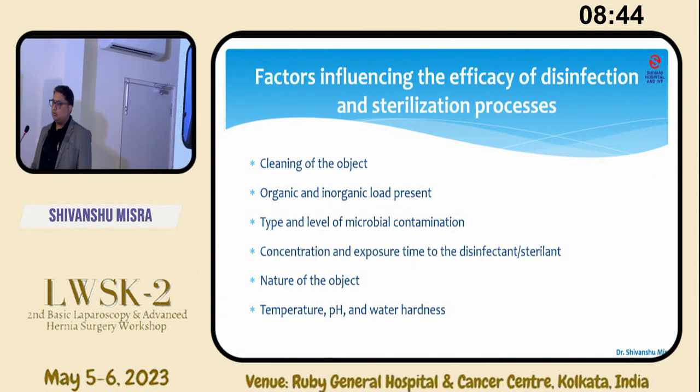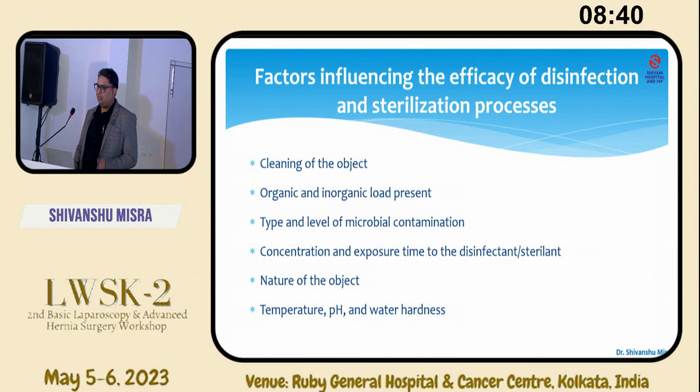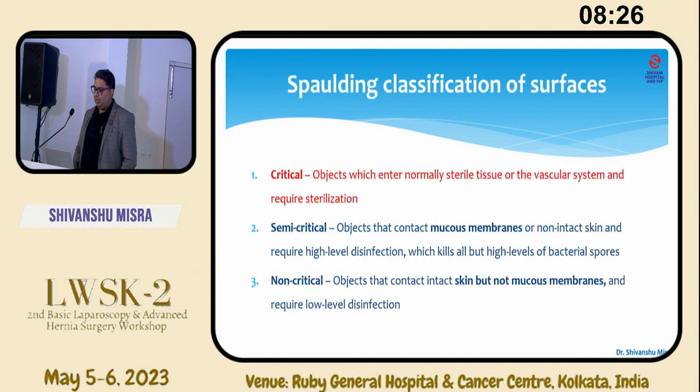As we all know, sterilization begins once we clean the instruments, either by a normal tap wash, and then we dismantle them, and then we clean with the normal brushes. We have to make sure that the sheath does not go off, and we have to debulk the organic and the inorganic load, and depending upon the type and pH, we then keep the instruments for sterilization.